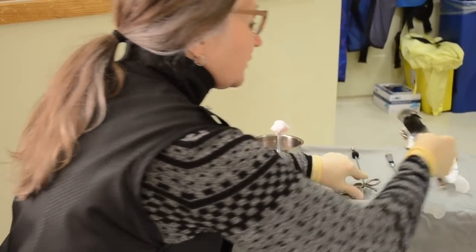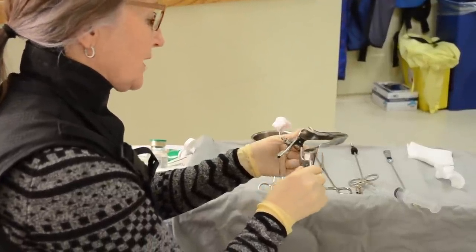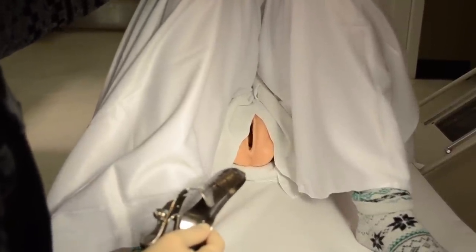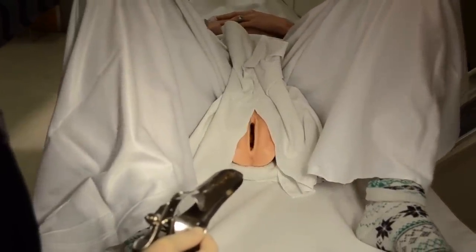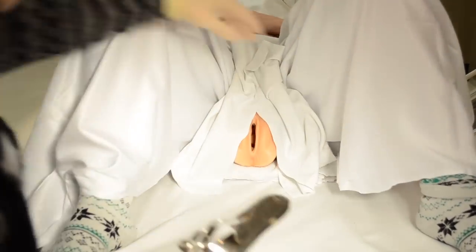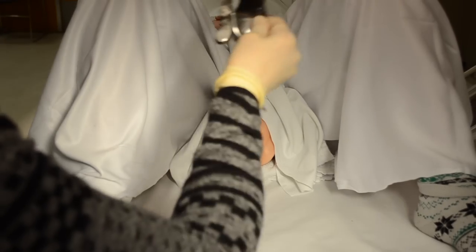I've already prepared my speculum by putting it under warm water. If we're using a metal speculum, that's mandatory. And then I put a bit of lubricant on. We're going to start this examination. I need you to move your knees out to the side just a bit — just a touch more, that's excellent. Once we've got the instruments in place, I'm going to move your ankle a little bit off to the side, which makes it a little more stable for your legs, and I've got a really easy ability to see what I need to see.